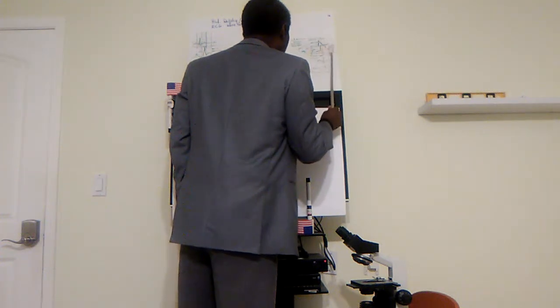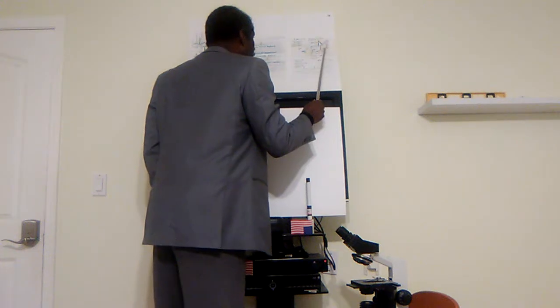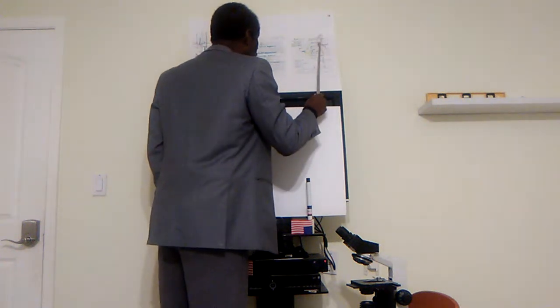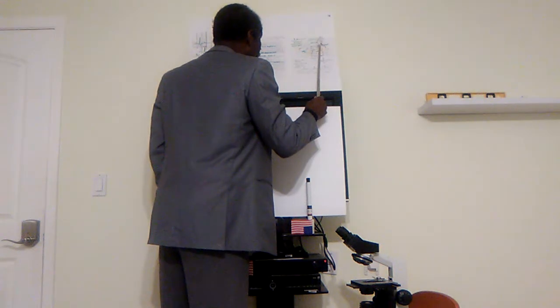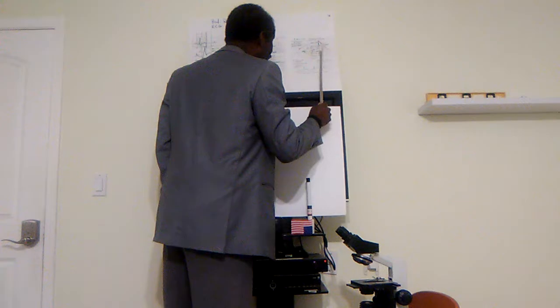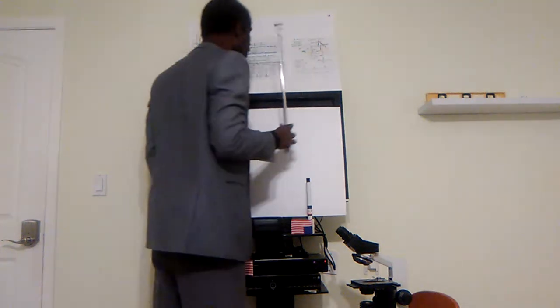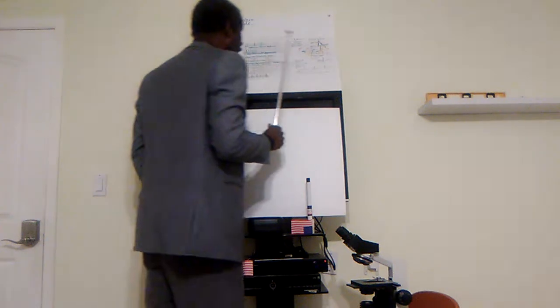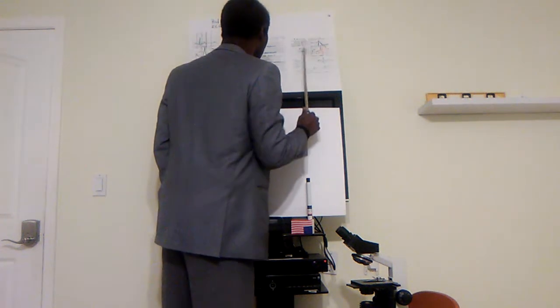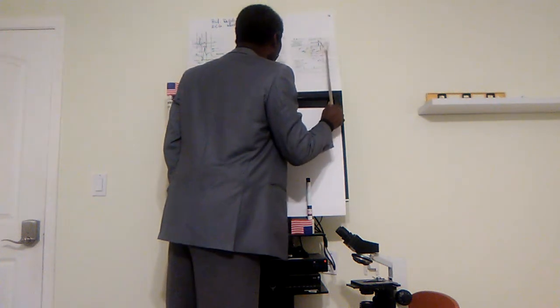I don't know if this video can differentiate between the color codes used in this representation. This one was orange, then this was blue, this was sky blue, this was sort of violet, and then this was yellow. But I don't know if the differentiation of colors is seen very vividly. So the fifth, we have the bundle branches here, and this is a signal for the bundle branches.